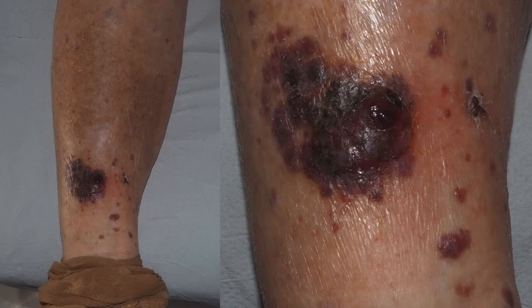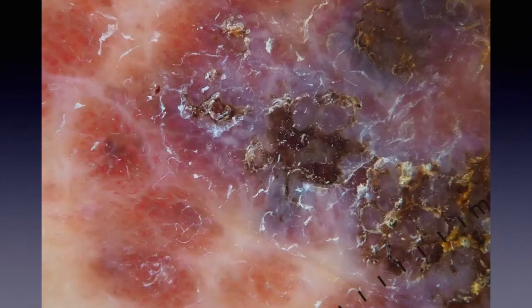This is an elderly lady who was coming with this strange lesion. It's an ulcerated nodular lesion with satellites. In a previous biopsy, the pathologist was not able to make a diagnosis. In my view, this is very suspicious for melanoma, especially for the dermoscopy picture where you can see this blue-black rule, so the presence of blue and black color, and this is very highly specific for advanced melanoma, for advanced primary melanoma.